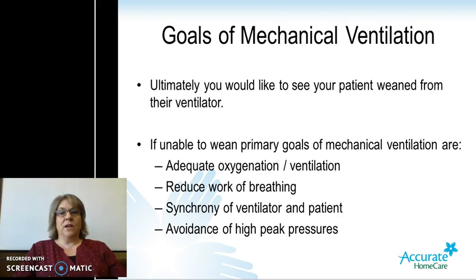Some goals in mechanical ventilation. Ultimately, we would love to see our clients weaned from their ventilators. Not realistic for a lot of the population that we see. If we cannot get them off of their ventilators, we want to make sure we adequately oxygenate and ventilate that patient. Oxygenation and ventilation are two very different processes.